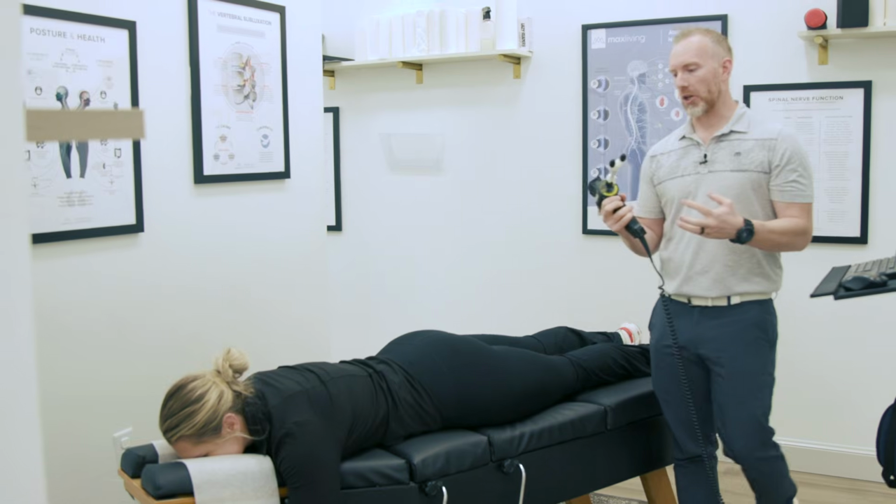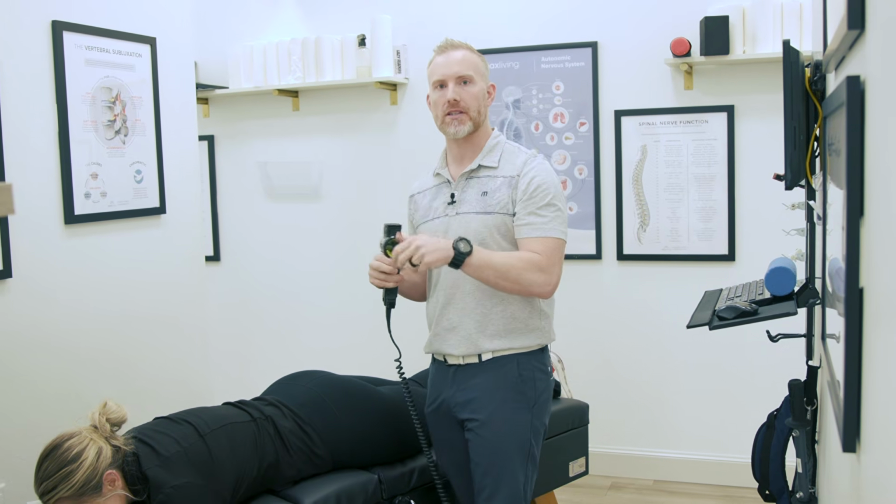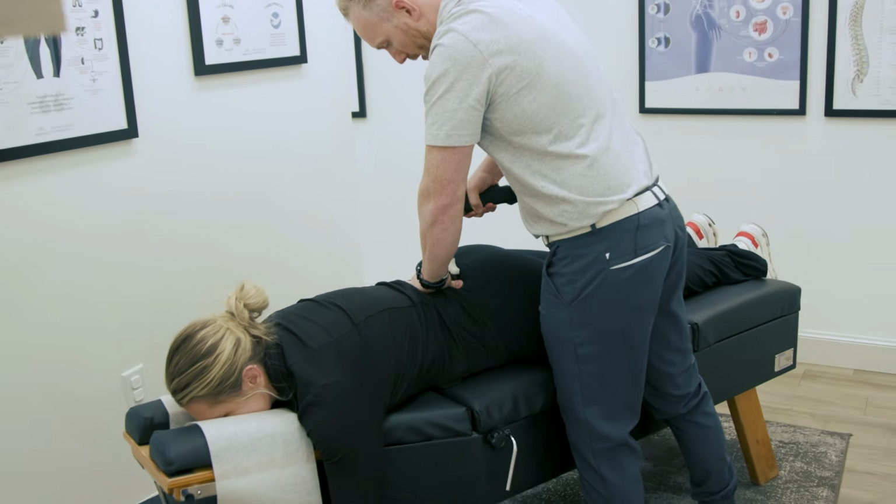So let me kind of show you how we correct that. For this, we're going to use the Arthrostim, and the Arthrostim is actually one of the only chiropractic adjustments that's known to help correct the curves in the spine. So we're going to come right through here.